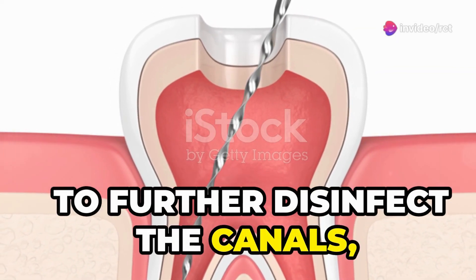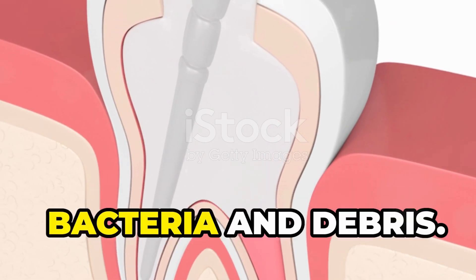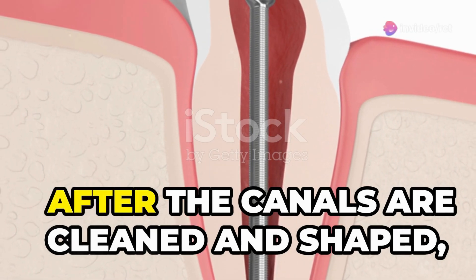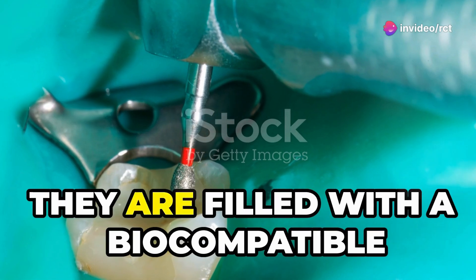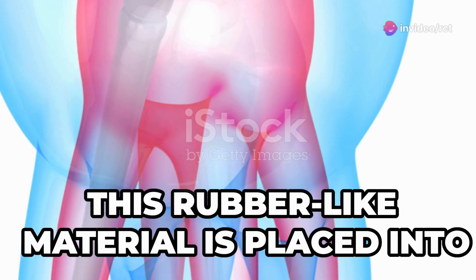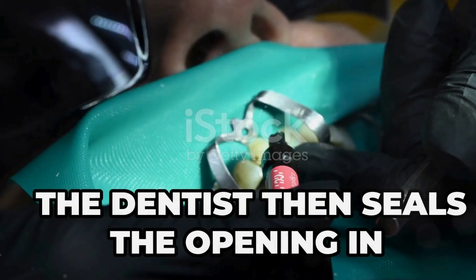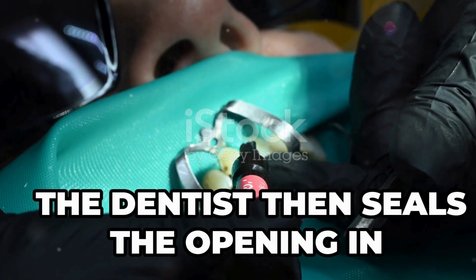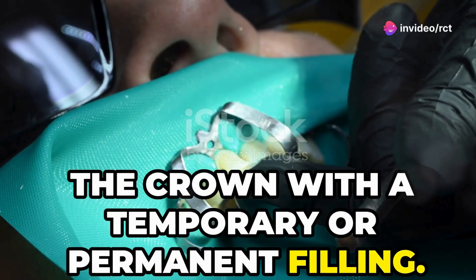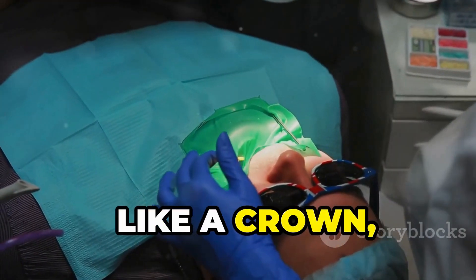To further disinfect the canals, the dentist may use an irrigation solution to flush out any remaining bacteria and debris. After the canals are cleaned and shaped, they are filled with a biocompatible material called gutta percha. This rubber-like material is placed into the canals to seal them and prevent future infection. The dentist then seals the opening in the crown with a temporary or permanent filling to protect the tooth until a permanent restoration, like a crown, can be placed.